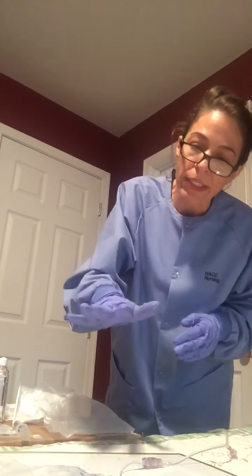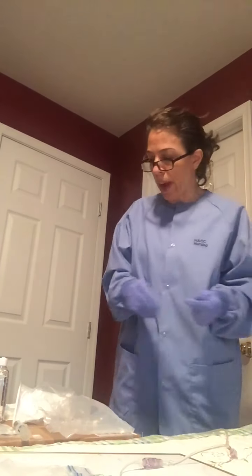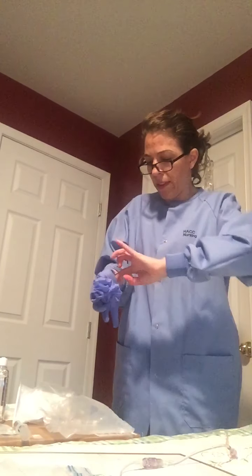So I would then make sure my patient's okay. I would assess the site, making sure that I'm not seeing any signs of infiltration, and I'm not. So I would have the rail up, patient back down, and the call button nearby. I would clean up all my supplies, take off my gloves, and perform hand hygiene, and that would be my IV and tubing setup.